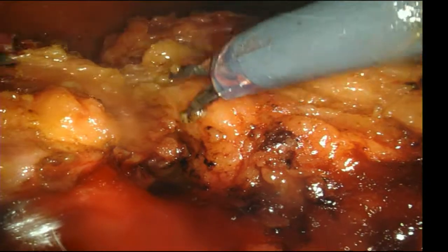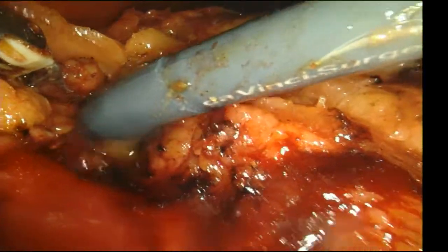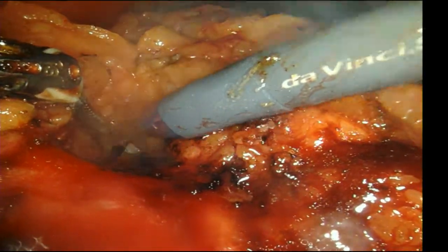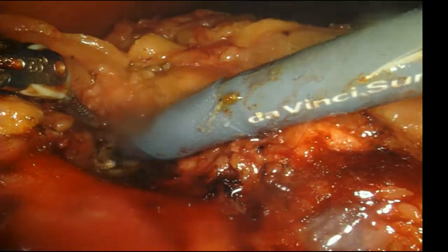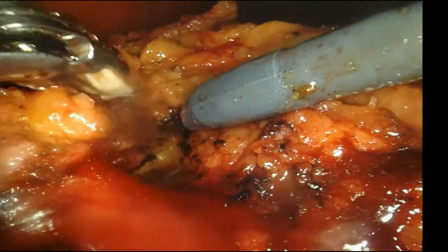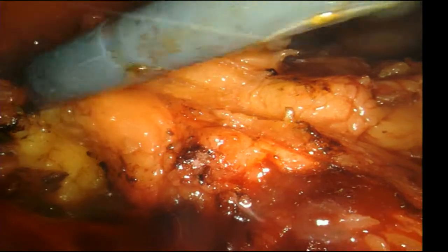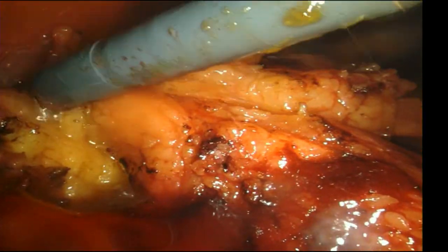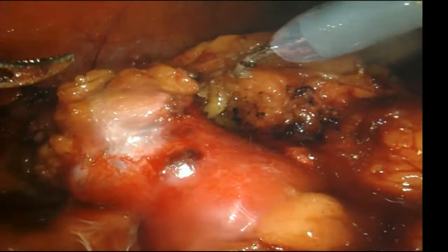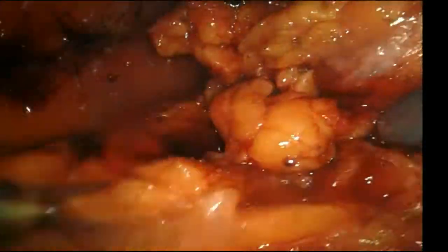But similarly, those lower pole tumors can be extremely challenging, and sometimes you need to get some anterior kidney exposure, and you can't get that necessarily if you're retroperitoneal and your camera's coming down on it. And so I agree with you. Those lower pole masses, you really need to go transperitoneal. Yeah, I think most of my cases are transperitoneal, but the hilar posterior tumors, definitely retro. Those are always much better retro.